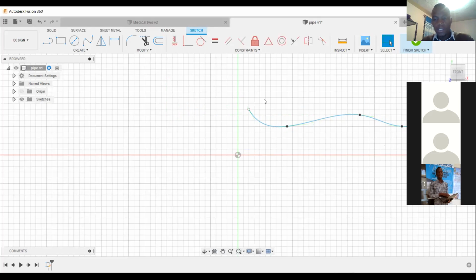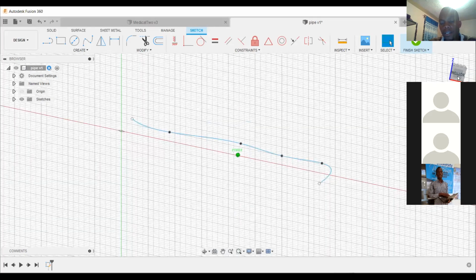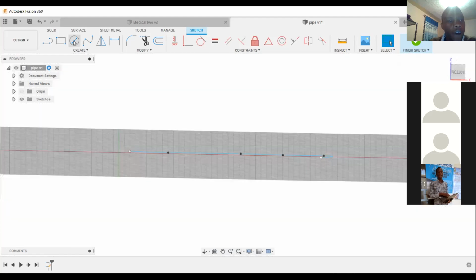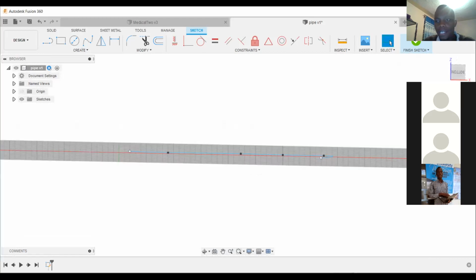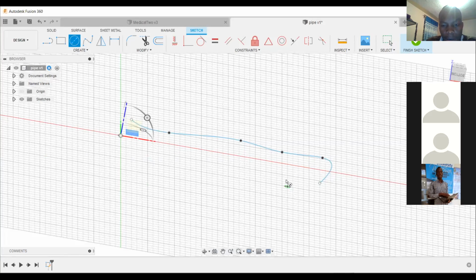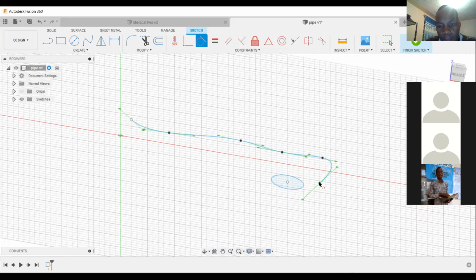So this first one I'll delete. It's just a line you've drawn arbitrarily, and you can rotate it whichever way you want. And then you draw a circle at the point where the last one ended. But this is where the trick is. You want to draw a circle first, then you make it tangent.